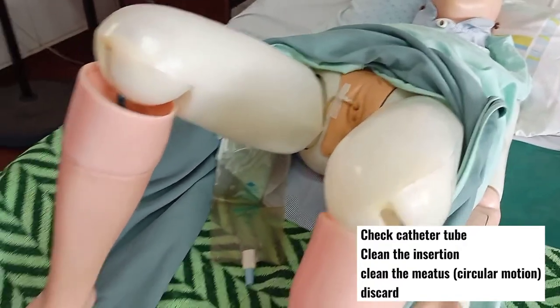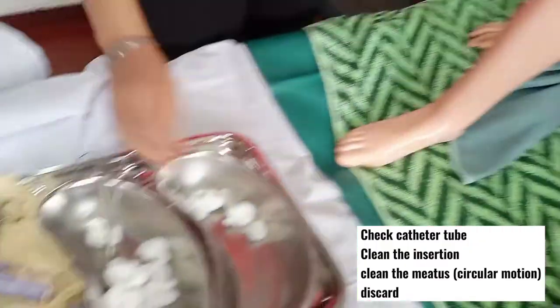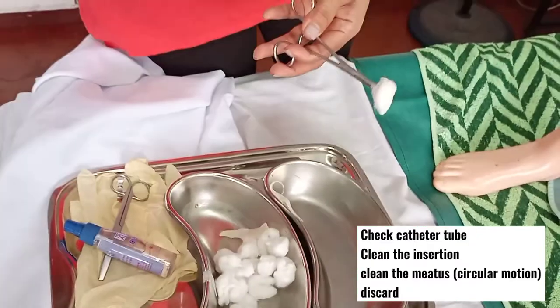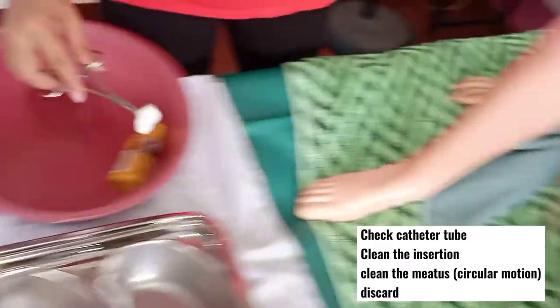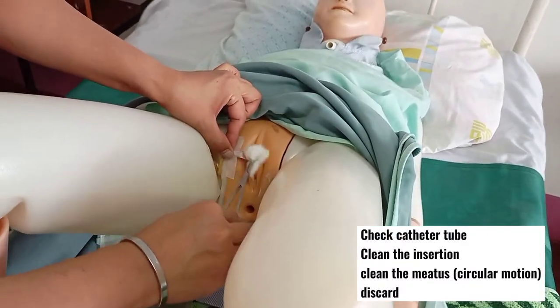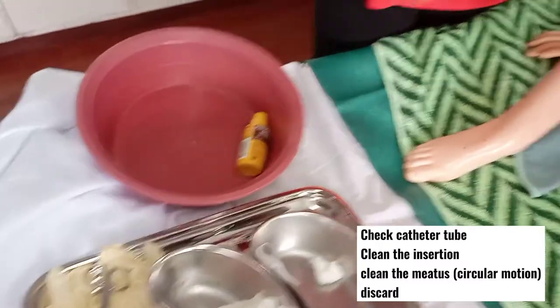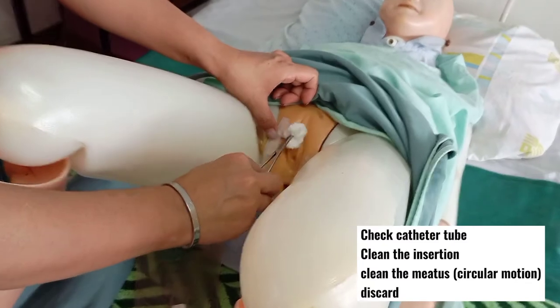Clean the insertion site. Get cotton balls soaked in betadine solution, hold the tube, and clean the insertion site three to four times, then discard. Get another cotton ball soaked in betadine solution, clean the urinary meatus in a circular motion, then discard.